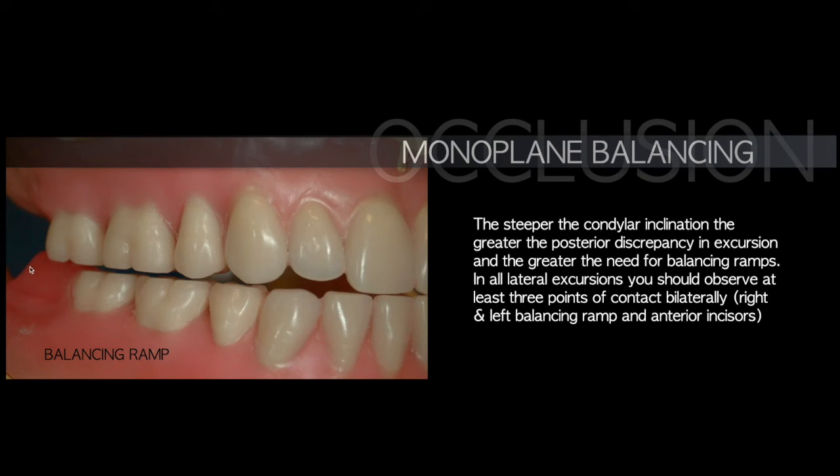This wax bump creates the second and third reference contact points when incising, in protrusion, or in lateral excursive movement, allowing us to have bilateral balancing contact.